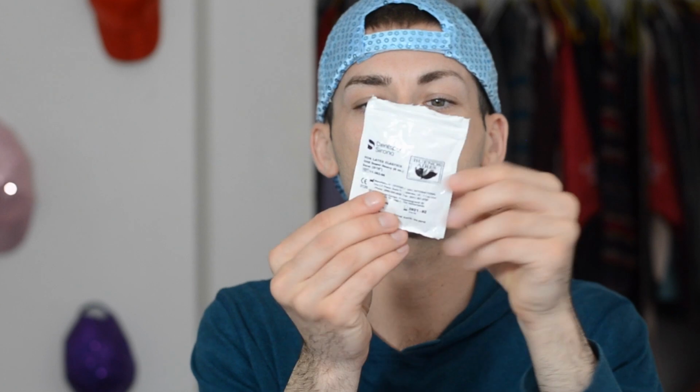These are what the elastics look like. They come in a little bag like this. They give you a little plastic hook thing to attach them if you want, but I've literally never used that ever. I just use my fingers to hook it on the back and then around the top of the top retainer. And I don't mind the elastics because the way that the elastics cross, they would actually cover up where the gap was.